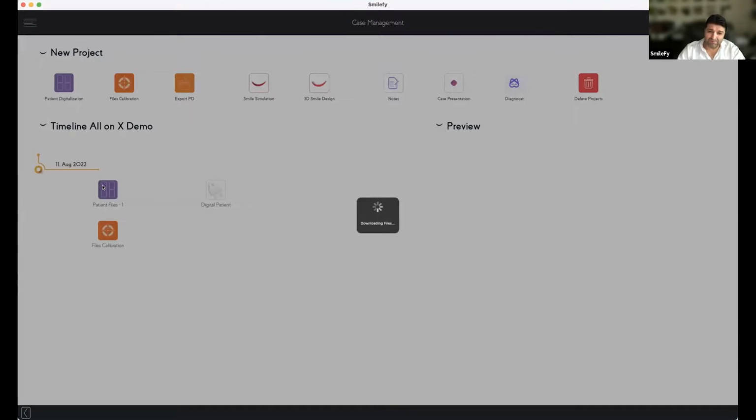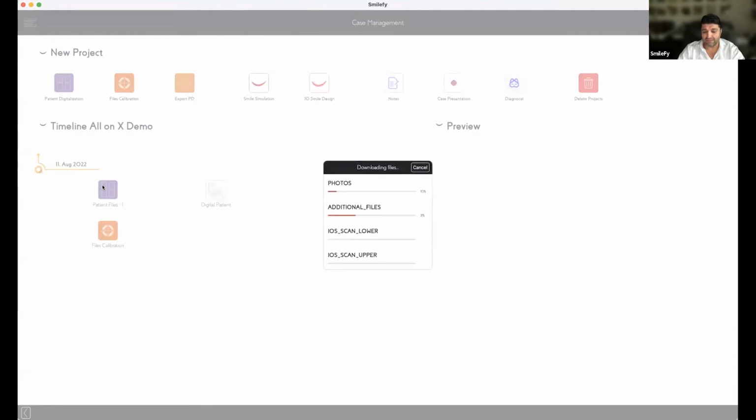So one of the first problems that I see very, very often is if you have a patient with a really bad situation, it's very, very hard to get the picture properly.